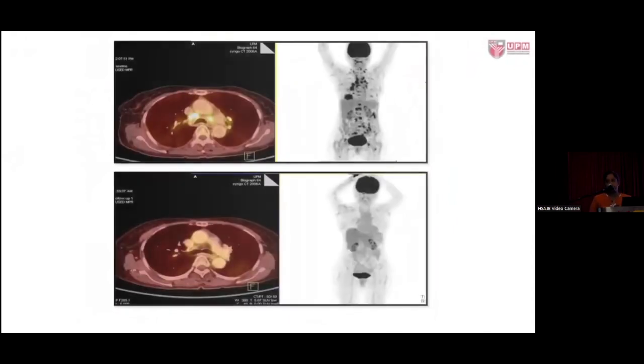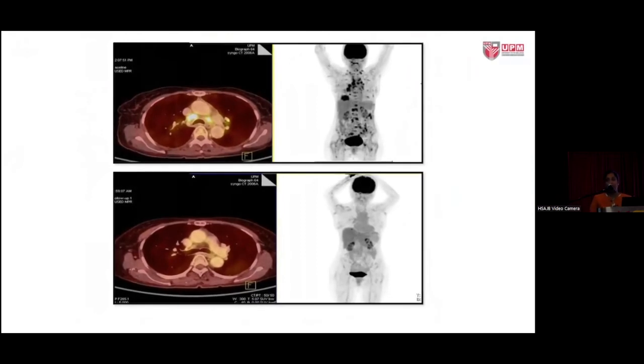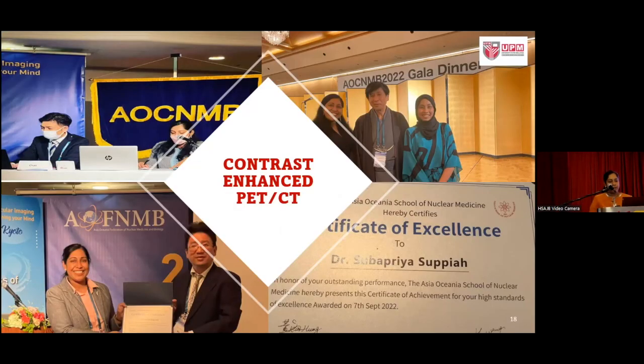PET-CT, although it's the more advanced technology, was the one that was combined with CT first, and SPECT was later. So PET is very well established as a hybrid imaging technology, and we know how useful it is in oncology imaging. And I just want to share some updates about PET.